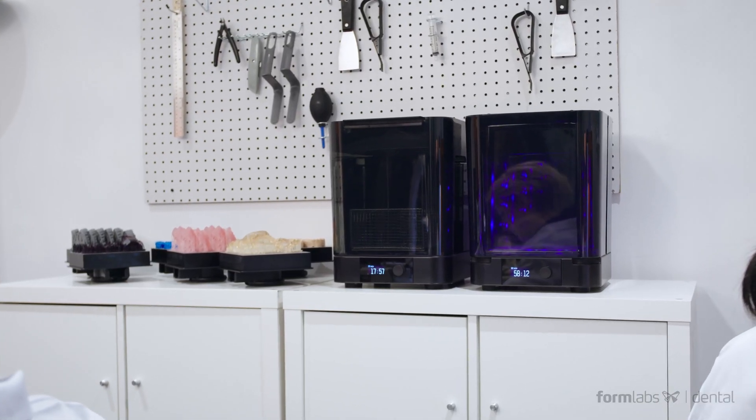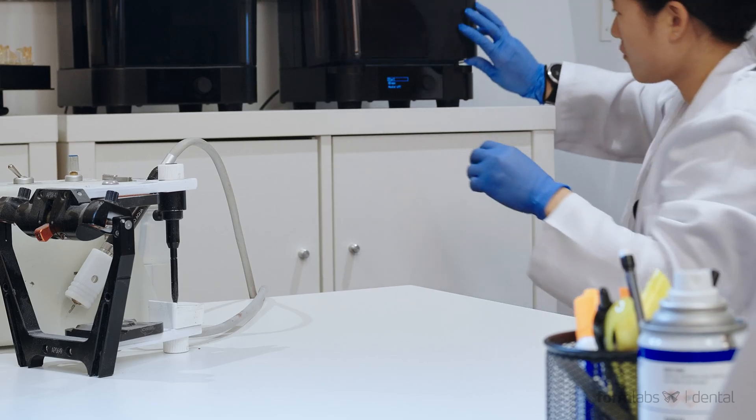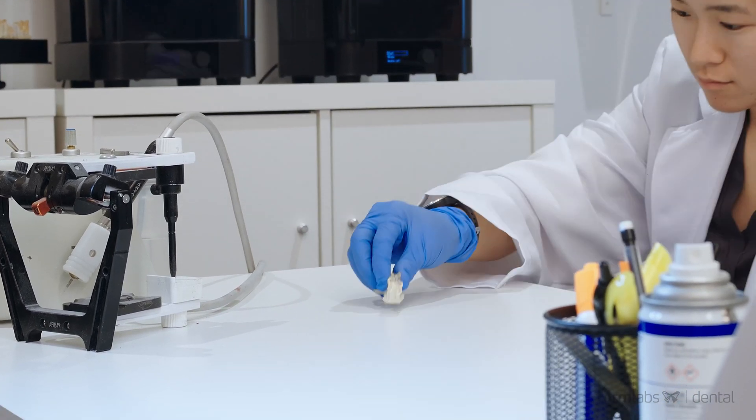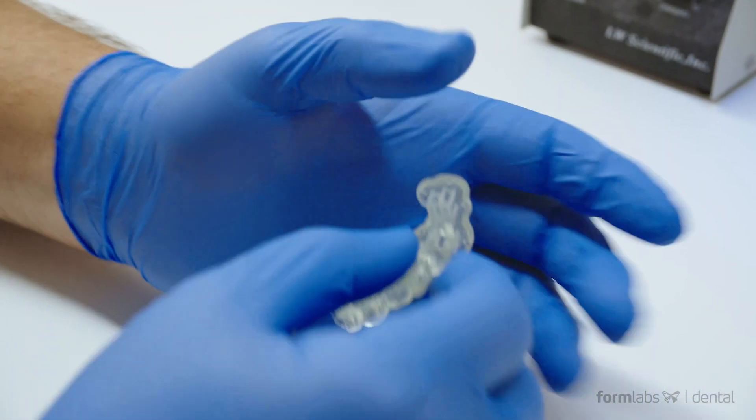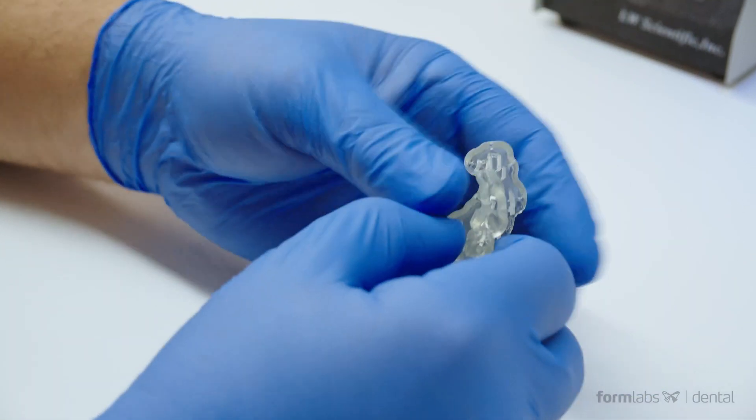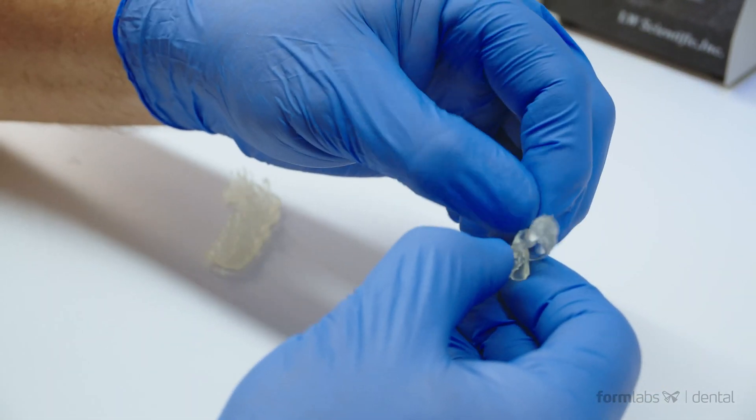you can take it to the finishing station, where it will be washed in IPA, post-cured, and prepared for use. Light touch supports make removing support structures easy and leave virtually no marks on the part's surface.